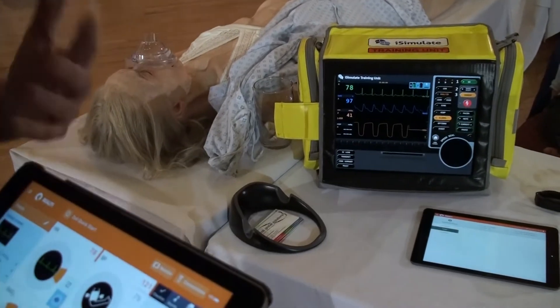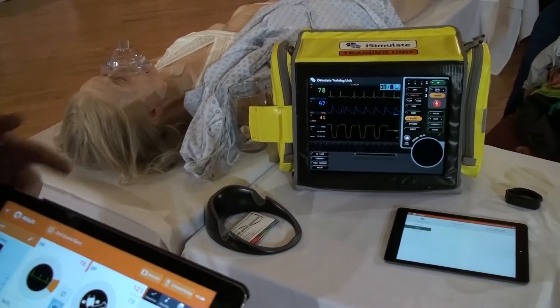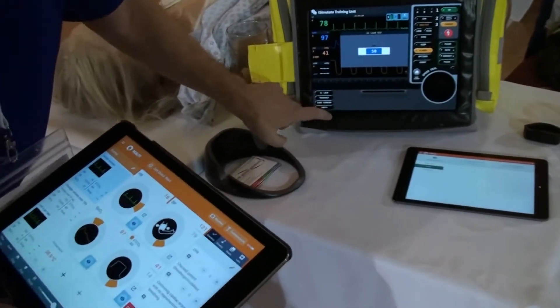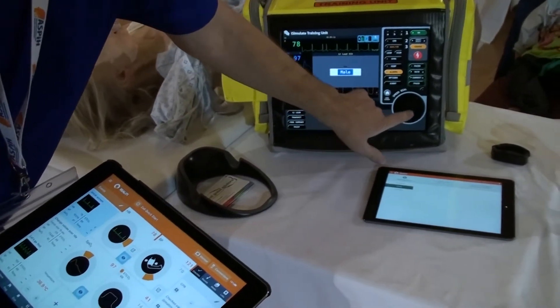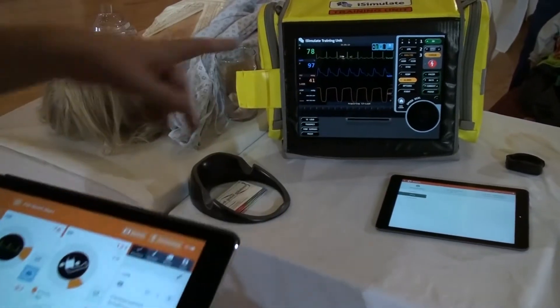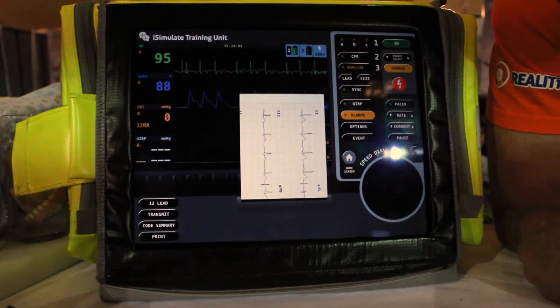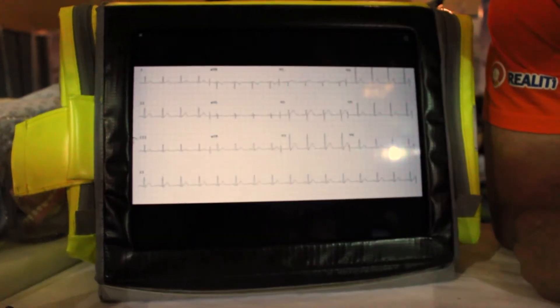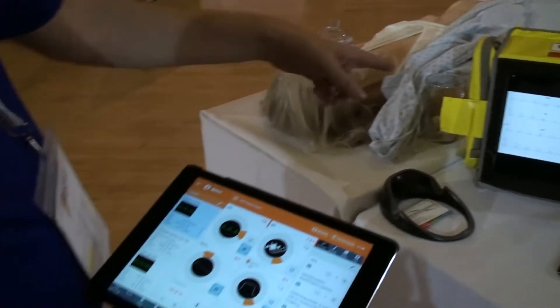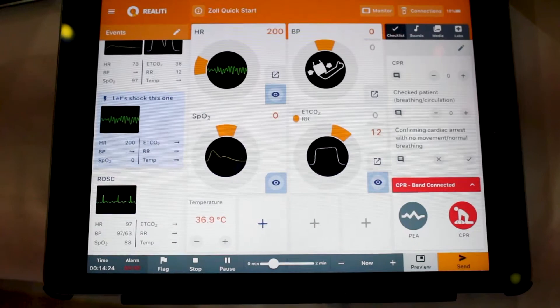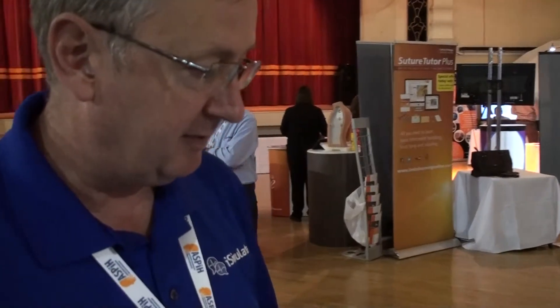I'm going to show you something fun because I know that people in the sim world like things that are a bit geeky. Let's do a 12-lead ECG on a 50-year-old male. It's going through the acquiring process like the real device would, and then it brings up the 12-lead ECG. The amazing thing is that the ECG is matching exactly the rate and morphology that I've chosen to send from my screen. We have nine different monitors at the moment, with more coming every week.